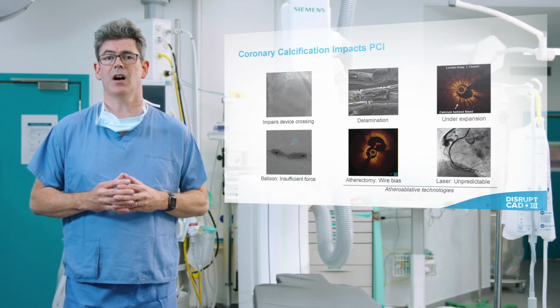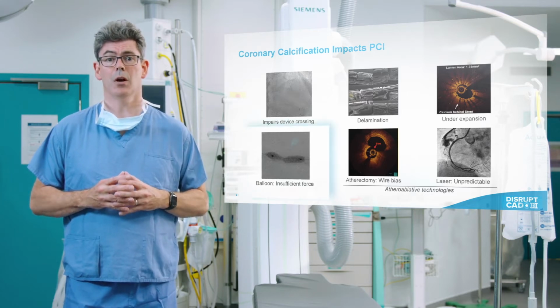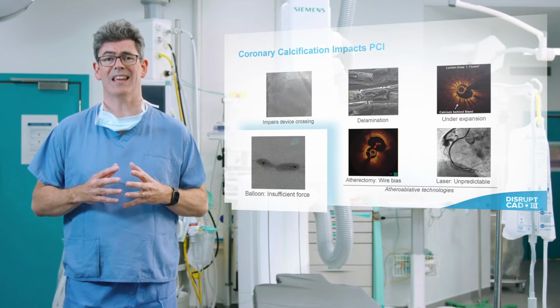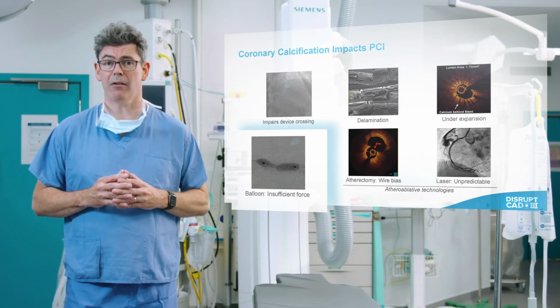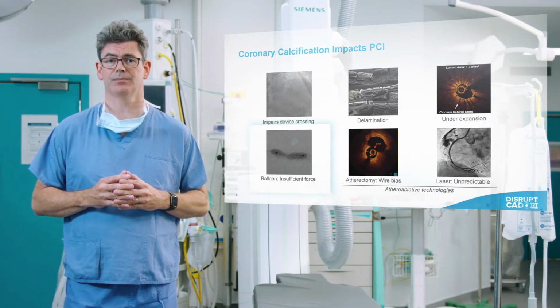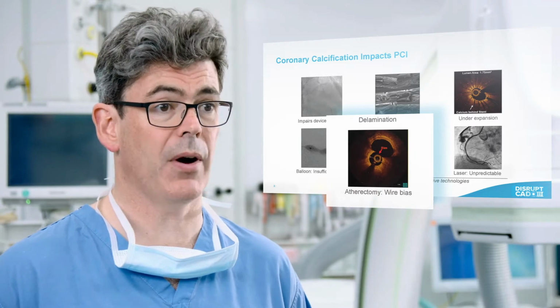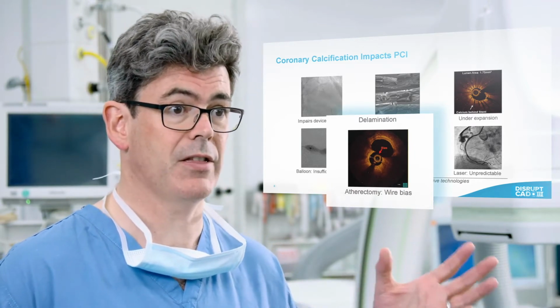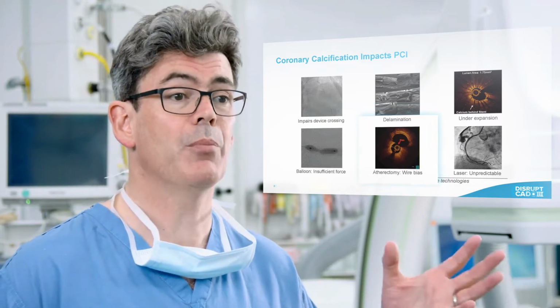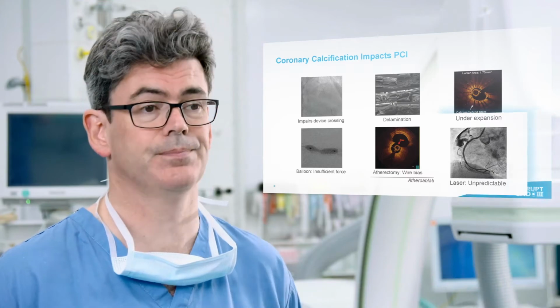Current technologies are limited with respect to their ability to treat calcium. Balloons have insufficient force even at 20 to 30 atmospheres. They are complicated by barotrauma and rupture. Atheroablative technologies are limited by wire bias in an incredibly eccentric rut or trough created by atherectomy, or unpredictable complications such as perforations caused by laser.